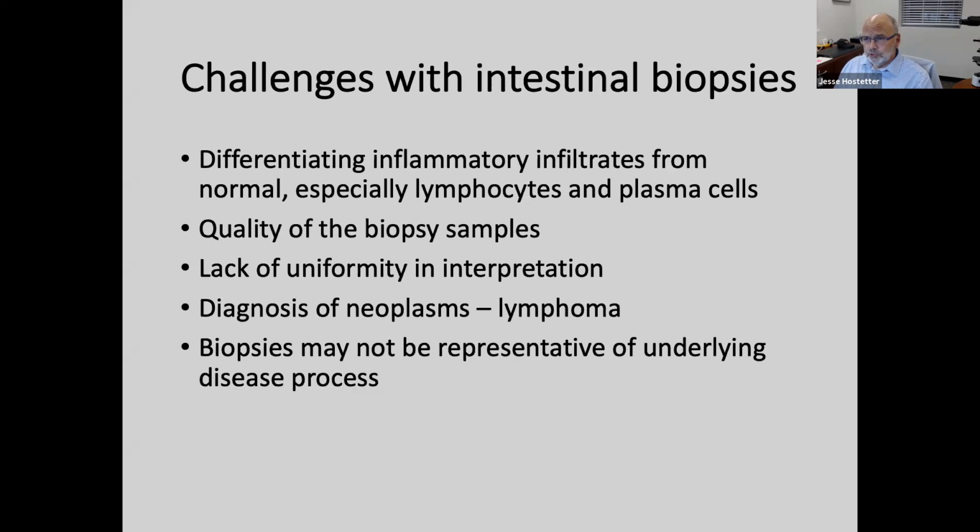And also, we're talking about an organ with a vast surface area, and biopsies may not be representative, and so you may not have a picture that's accurate for the underlying disease process, and that's frustrating for us as pathologists, but it's also frustrating for clinicians when the report we send out doesn't make sense compared to the clinical picture.